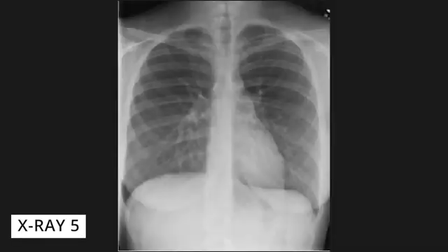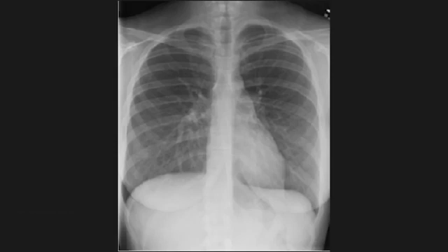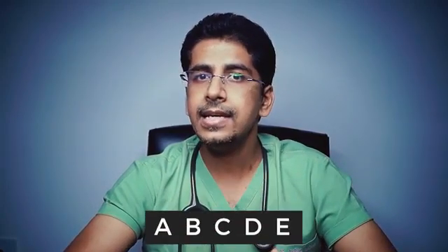Now, whenever you need to read or interpret an X-ray, you need a systematic approach, right? Either it can be remembered by a mnemonic A, B, C, D, E, or you can read the X-ray from inwards to the outwards.